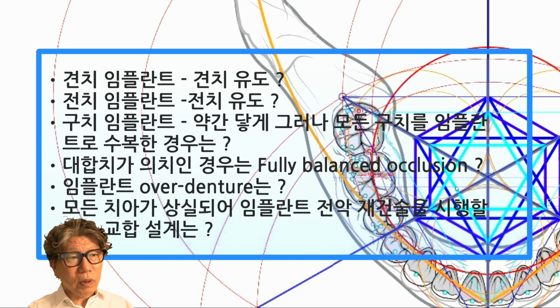He also talked a lot about the results of overdentures. At that time, implants were very expensive, and there weren't many people who used them. Overdentures are typically done with either 2 or 4 implants. In most cases, 2 implants were used. In my memory, the 5-year success rate for 2 implants was around 82%, or 80%, whereas the 5-year success rate for 4 implants was close to 90%. However, in the case of anterior guidance occlusion, implants are usually placed in the mandibular anterior teeth. In that case, they do not last long.